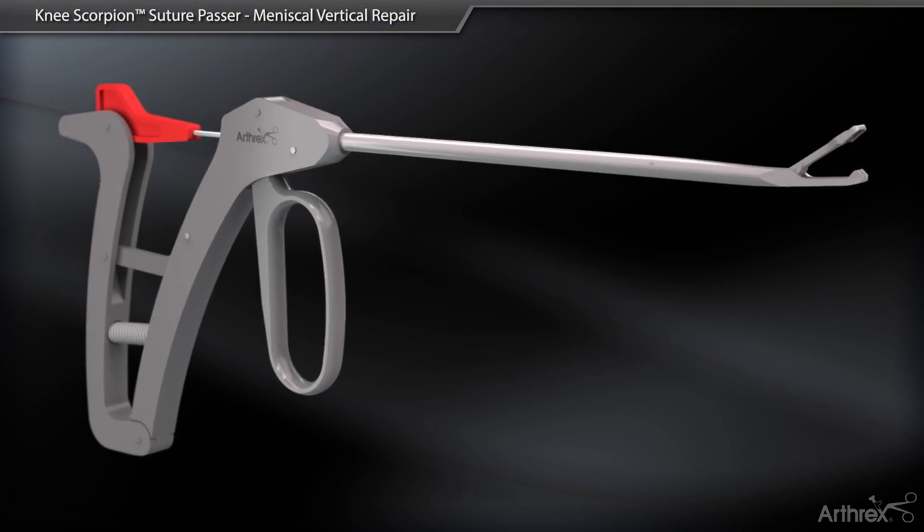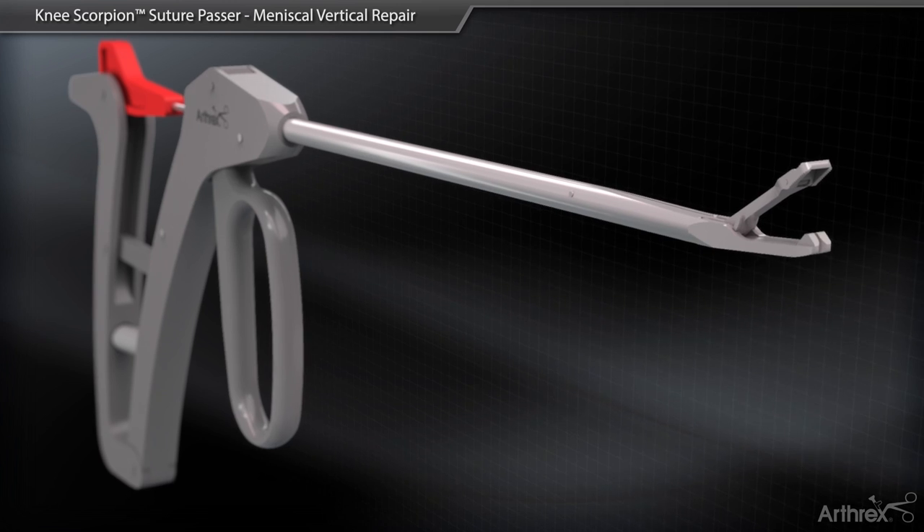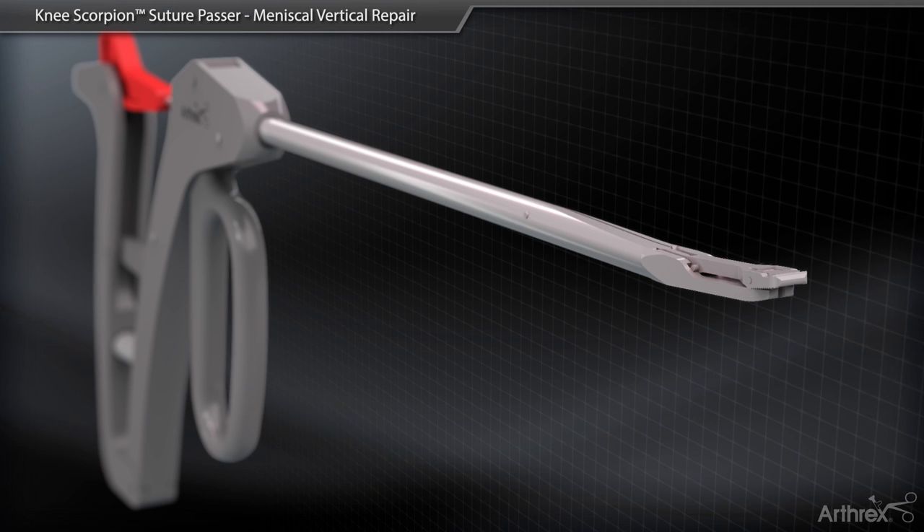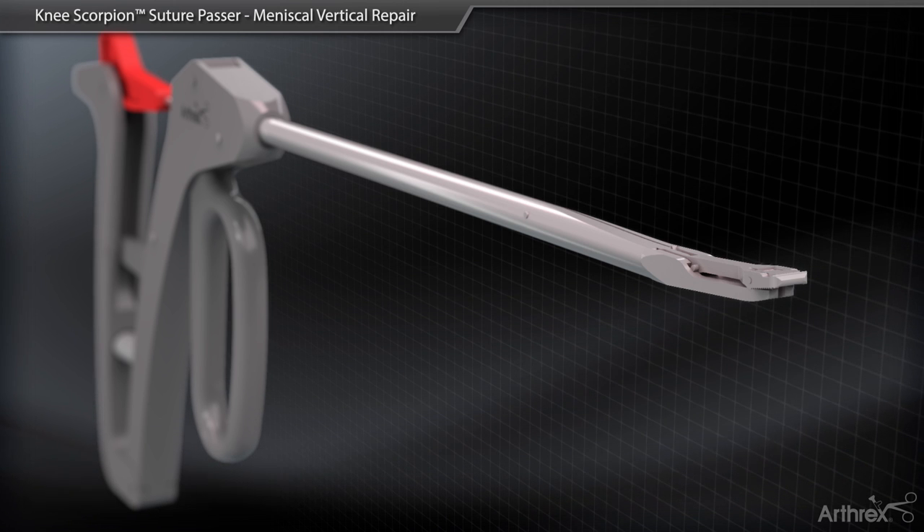The Knee Scorpion automatically passes and retrieves either 2.0 or 0 fiber wire. The low profile design allows access to tight recesses of the knee for various stitch configurations.